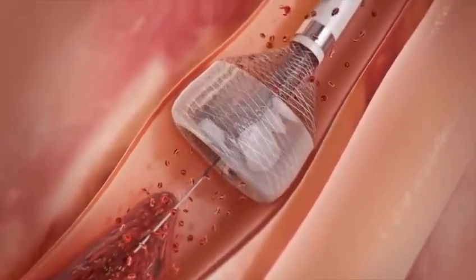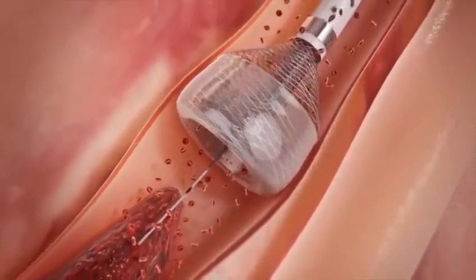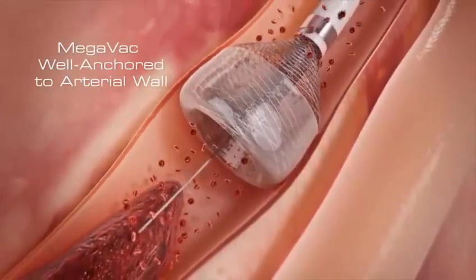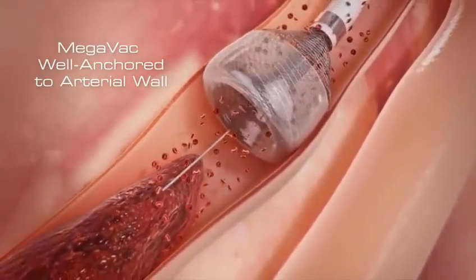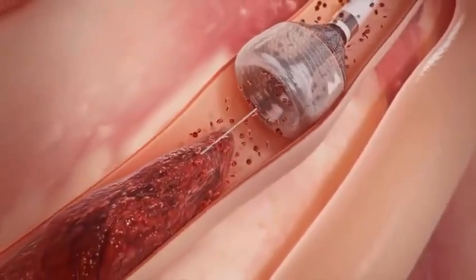This anchors the catheter firmly and safely. The outward expansion of the Megavac anchors and centers the device, and can be used as an anchor for other devices in crossing tight lesions or tortuous vessels.